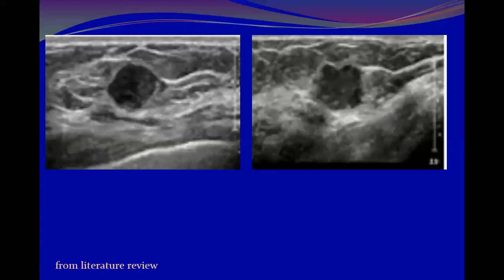Yes, the image on the left is less grainy. This one was done by one operator and this one performed by another operator. Same machine, same setting, skills different. As mentioned, the major disadvantage of ultrasound is operator dependence. You see? So this one is less expert than this one.